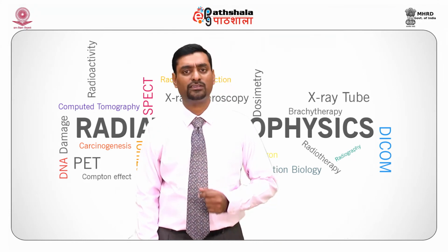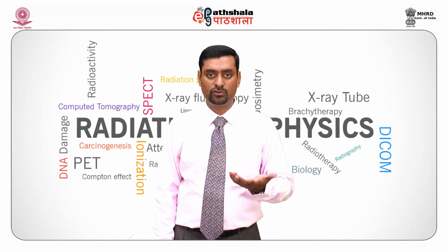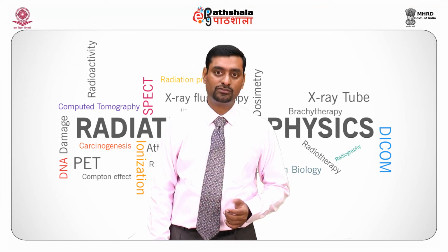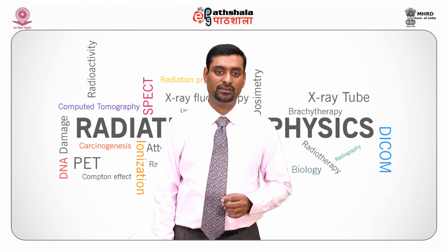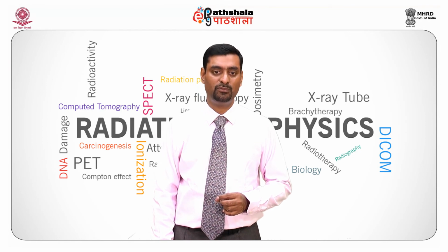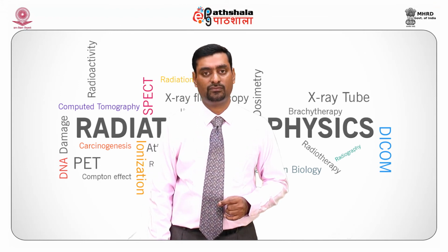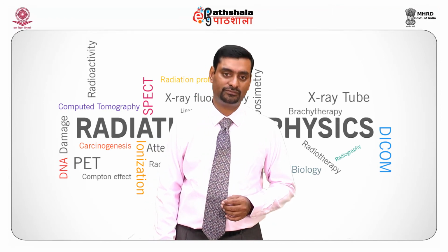Very close pH should be there, that is between 4 to 4.5. Let us consider what are the various constituents of a fixer. Fixer also has solvent, which is water, used in the fixing solution. It controls the activity of the fixer by diluting its effect. The fixing agent is a chemical which washes out the insoluble silver halide in the film emulsion, but does not dissolve metallic silver. What are these fixing agents? They are nothing but sodium thiosulfate and ammonium thiosulfate.